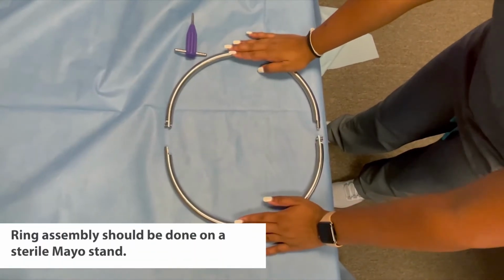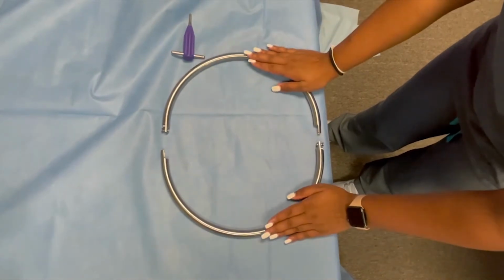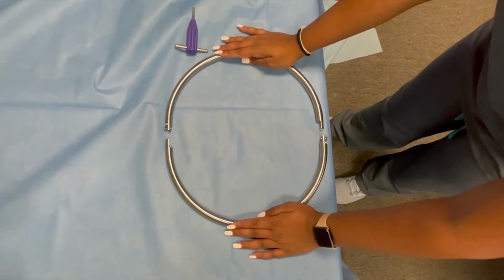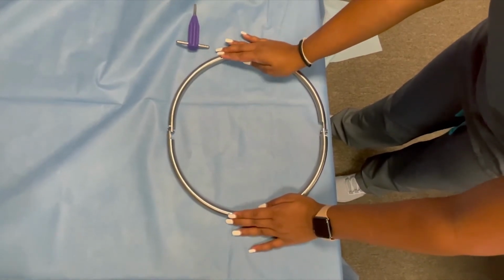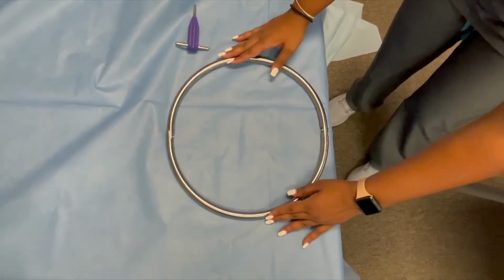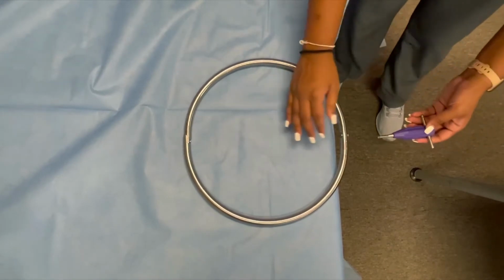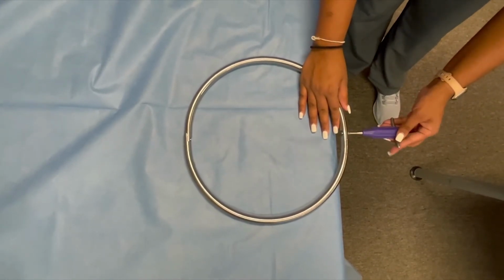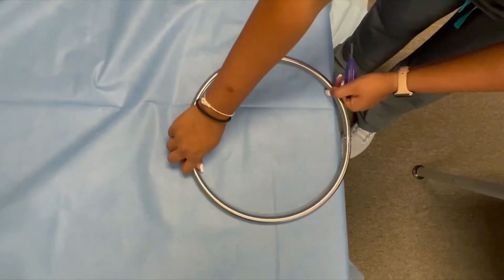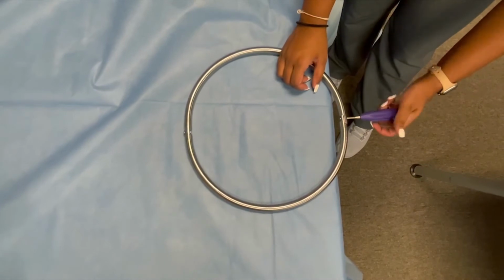Next, you're going to clear enough space on a flat surface to assemble the ring. You'll see the ring comes in 2 half sections. So you're going to align up the fork with the screw end on both sides and push together so that they go in. Next, you'll bring 1/2 to the edge of the table, which will allow you more room to tighten down the screw with your hex driver tool. And then you will rotate to the other side and tighten the other screw with your hex driver tool.